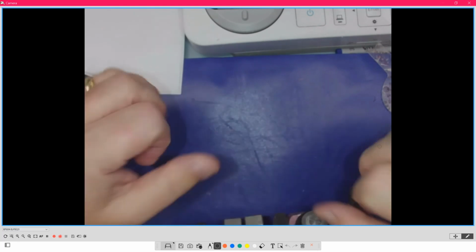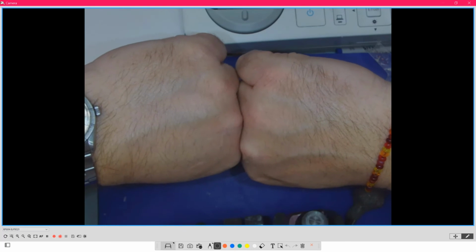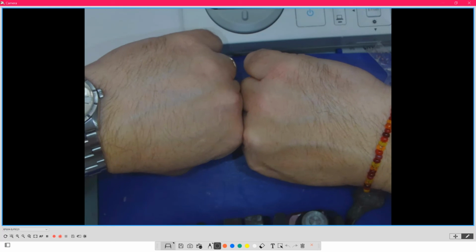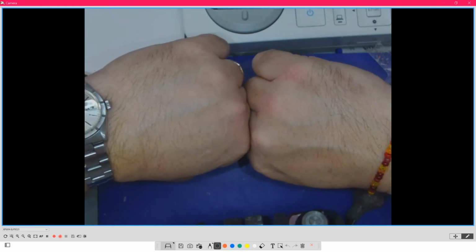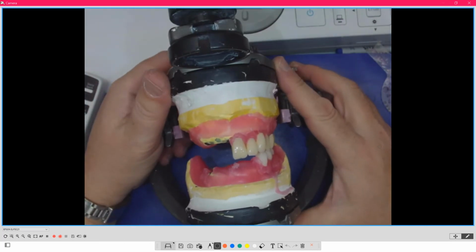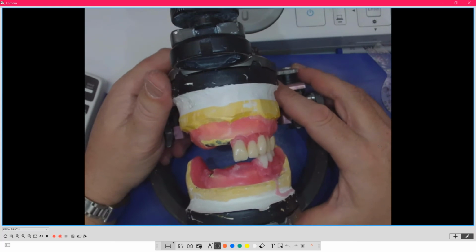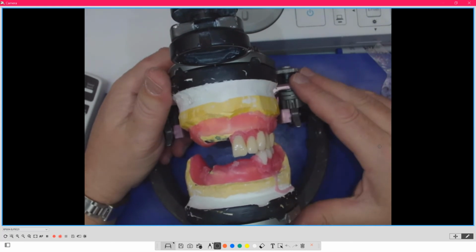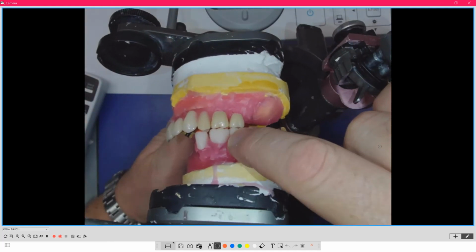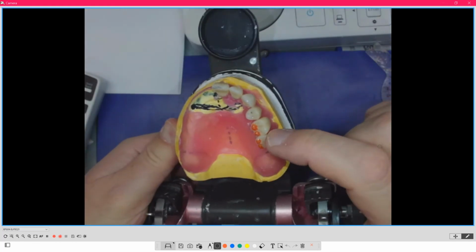Because here's the thing, if it's knuckle tight and it's this super tight contact, where do you think the food goes when they close in? The food gets pushed out because there's really very little space for the food to sit on here. So the food gets squished out and then it has to get put back on and then it gets squished out. This isn't efficient. It takes you more effort, twice the amount of effort to eat, in quotations, because you keep knocking the food off just to get put back on. You want to have these little bits of gaps in here so that the food stays on here to get brought up to here to get crushed.